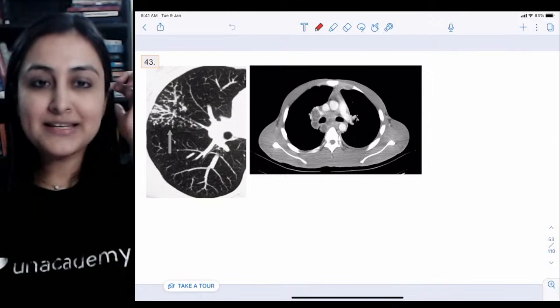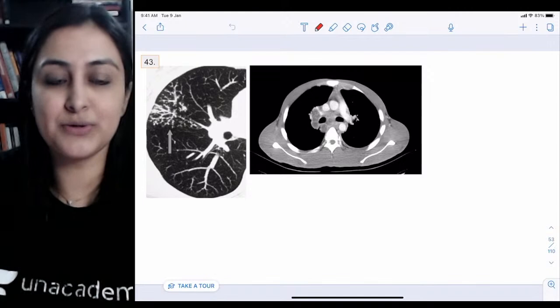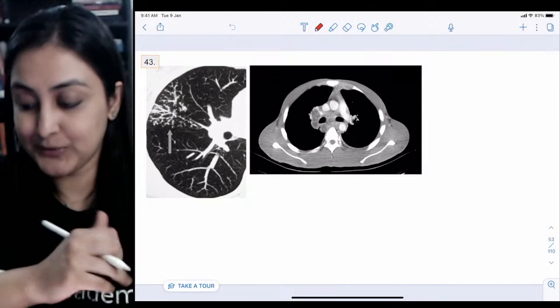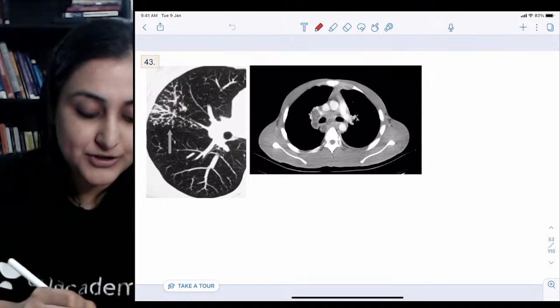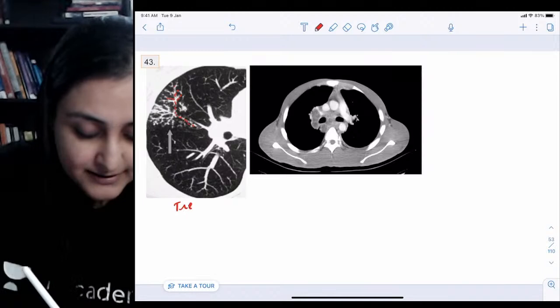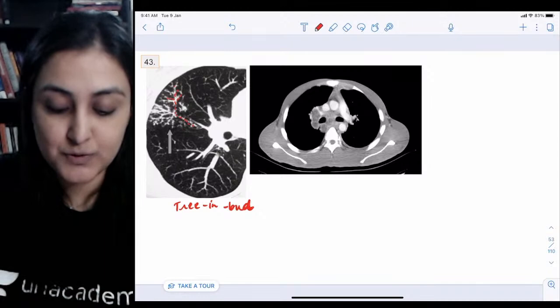Image 43 is about active tuberculosis. On this HRCT, along the bronchus you can see a nodular pattern that looks like a branching bud — this is called the tree-in-bud sign, or tree-in-bud appearance.